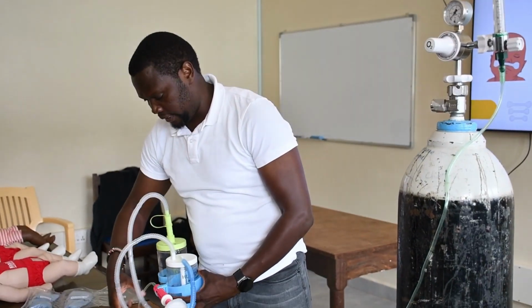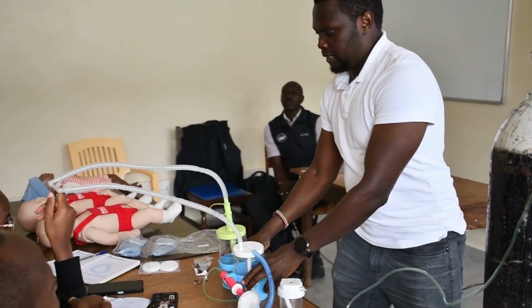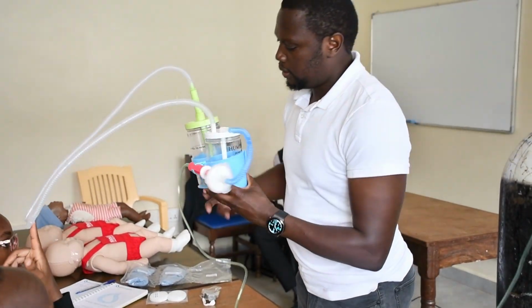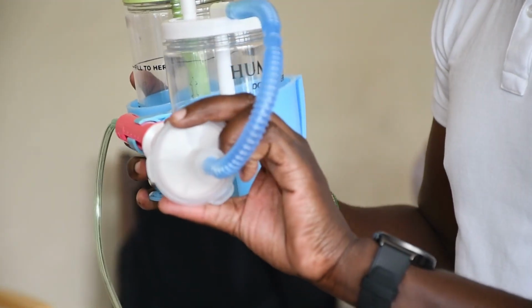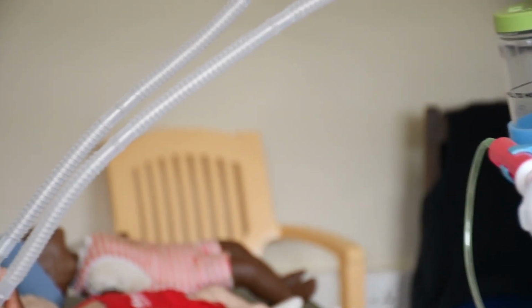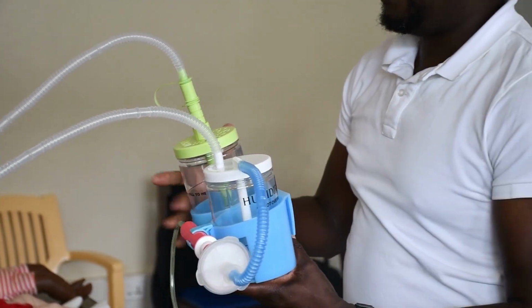So what is happening is, I have my oxygen source. I come in here, I blend it. After blending it, I filter it. After filtering, I humidify it. Goes to the patient. Based on how the patient is meeting their demand, they are able to exhale. As they try to exhale against these pressures here, the bubbling will happen in this.